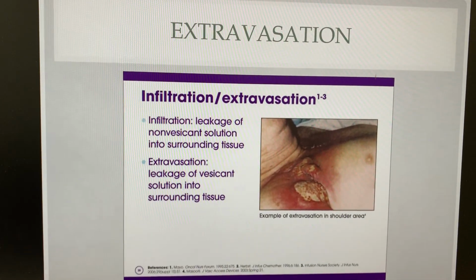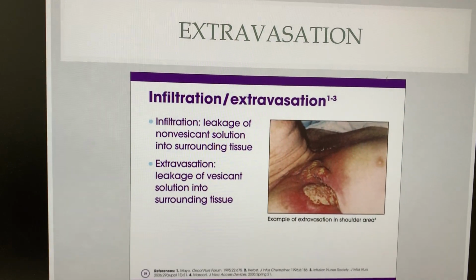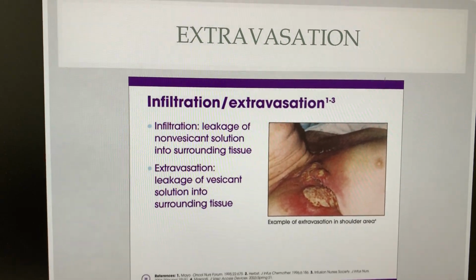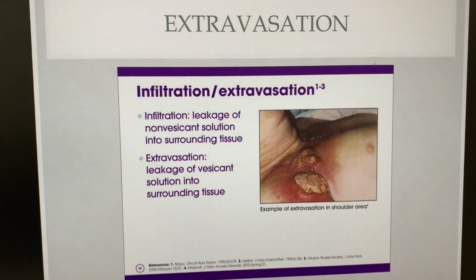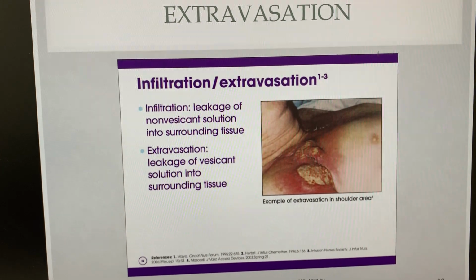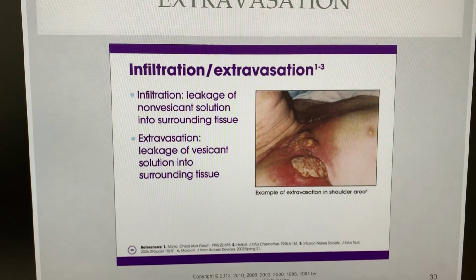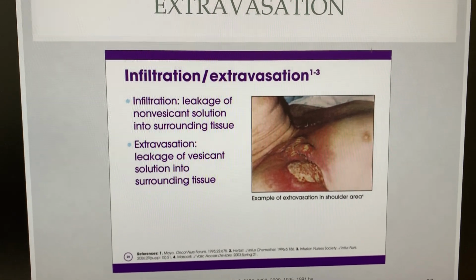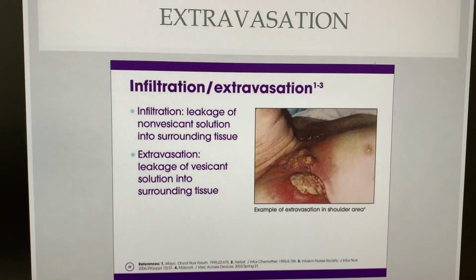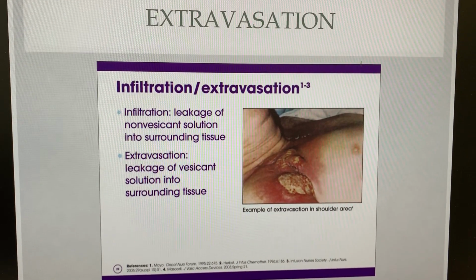Always, always. If they say their IV hurts, listen to them. If you don't see anything wrong, if it's not swollen, not red, not taut or hot or cold when you touch it, you can reassure them that it looks okay. I've had times where I can't see anything wrong, but I've offered to change it just because they're complaining of pain. Sometimes they would take me up on it. Other times they'd say, no, if you think it looks okay, just watch it. And then you have to do just that. You have to watch it. Listen to what your patient's telling you.